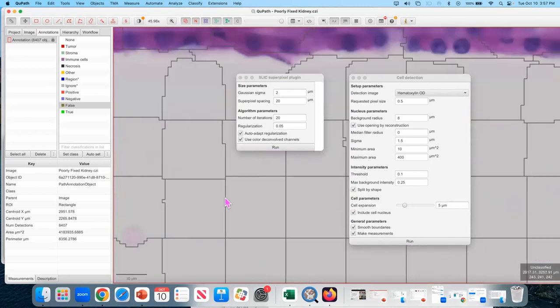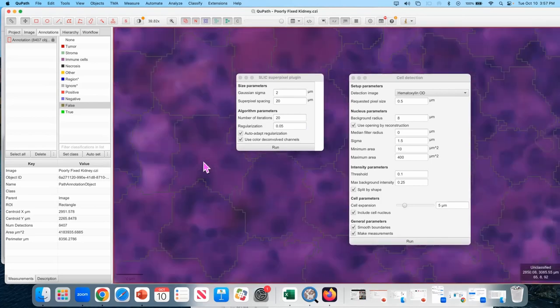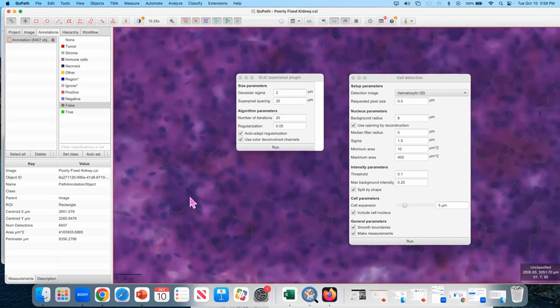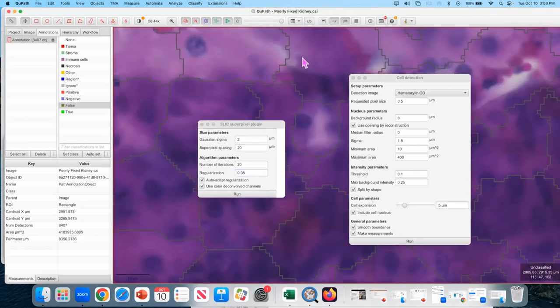So something like this, there's just not a lot of contrast here at all, so it just leaves them square. But as you get to something interesting in the tissue, do you see how this little blip is a little bit darker than its neighbors? And so it put a boundary in the intensity gradient. Here's a good one, at the edge of the fold, it put boundaries here.